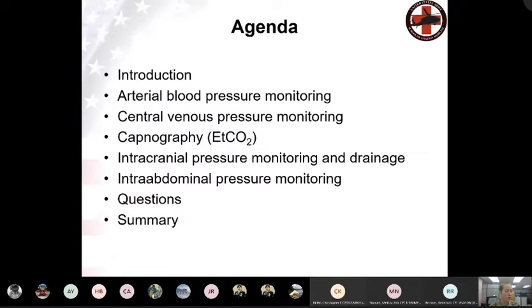Staff Sergeant Dumont, anything else you want to add? Not really. She pretty much covered the majority of it. Okay, but for any other reasons for invasive monitoring? Other than it's a lot more accurate than, like she was saying, doing a blood pressure cuff, because it takes out the possibility of the cuff being too small or too big for a patient.